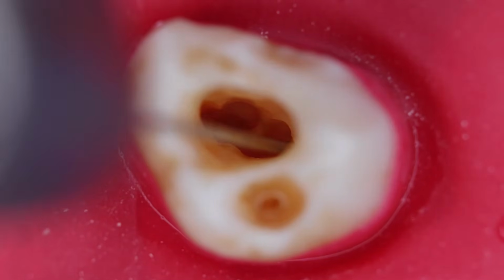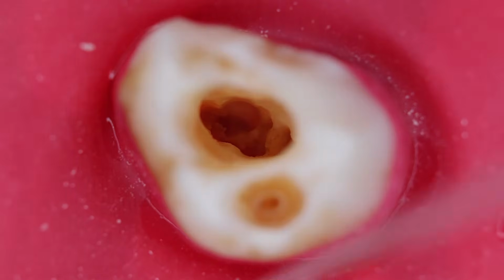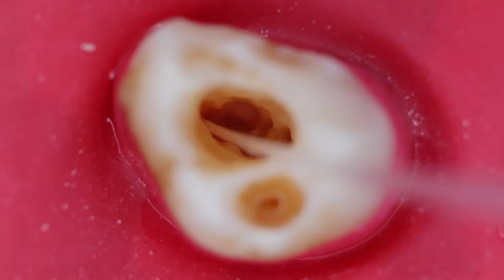Now enlarge the palatal canal orifice. So all the orifices have been enlarged with the GG drills, and irrigated.